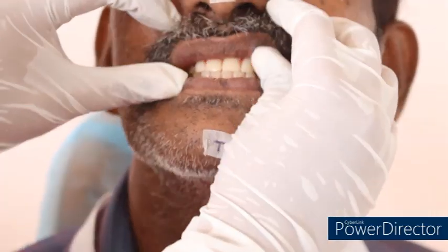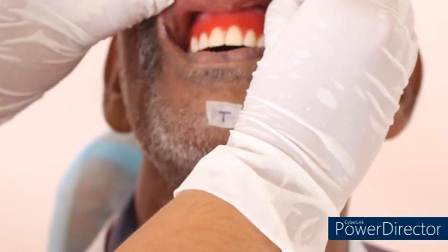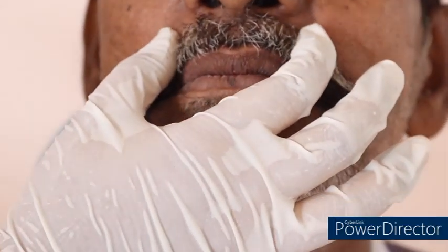So the fourth factor to be assessed is the lip support. You have the nasolabial fold and it should not be obliterated. This is because of the labial flange. The labial flange should be properly contoured for proper lip support, and it gives the natural appearance for the patient. The fifth factor to be seen is the buccal corridor.